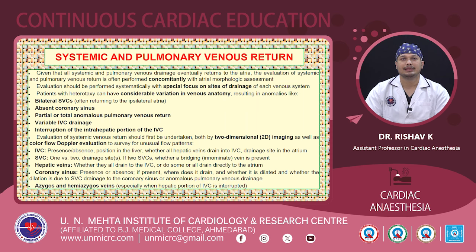And the patients with heterotaxy can have considerable variation in venous anatomy. So some of the more common anomalies can be bilateral SVCs, absent coronary sinus, partial or total anomalous pulmonary venous return, variable IVC drainage, as well as interruption of the intrahepatic portion of the IVC. Evaluation of the systemic venous return can be done both by means of 2D imaging as well as by using color flow Doppler evaluation for unusual flow patterns.